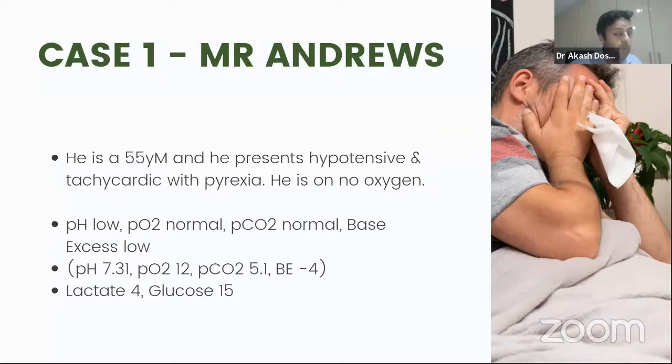Their lactate is 4, their glucose is 15. I don't really need to do an anion gap. I could if I had the other parameters, but essentially this patient has a lactic acidosis.